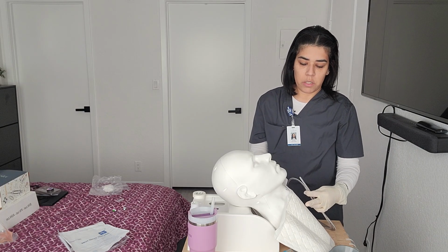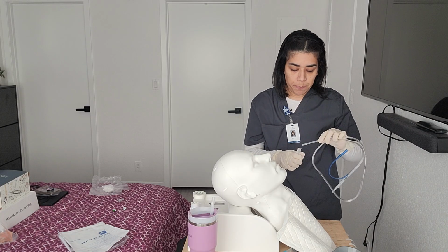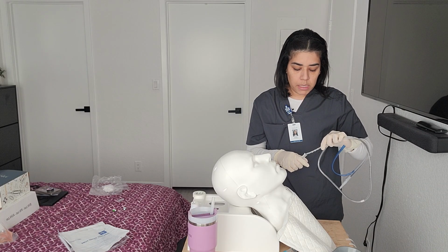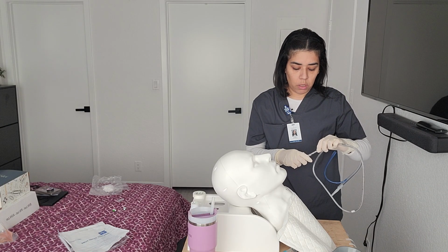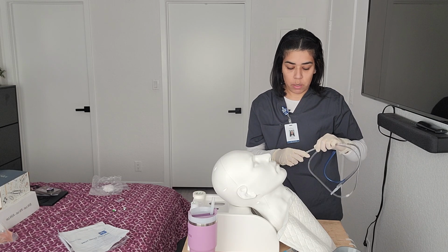All right, Mr. Manny, so what we're gonna do is we're gonna go ahead and start inserting the tube. If at any point you feel uncomfortable or you need to take a break, I'm just gonna have you raise your hand for me so that we know to take a break.